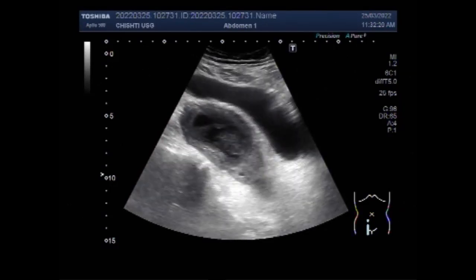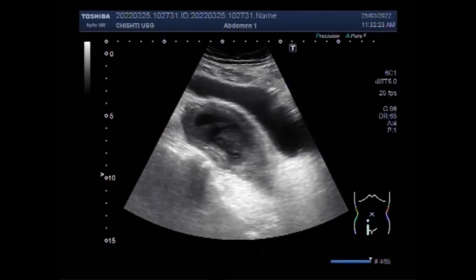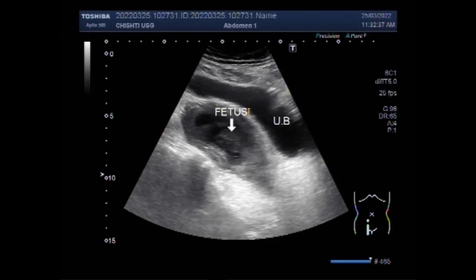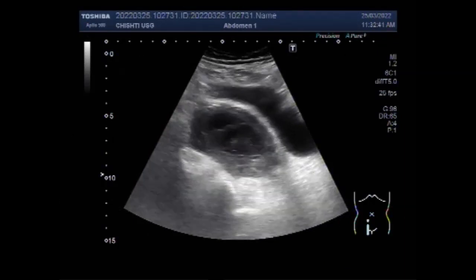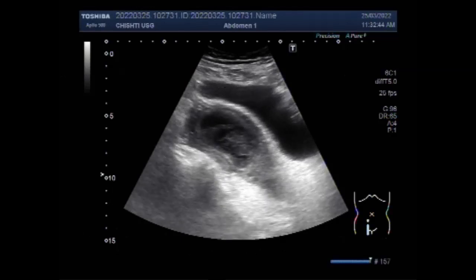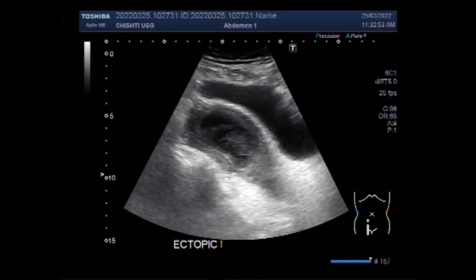Now you can see a small embryo in the right ovary. A small amount of fluid in the cul-de-sac is normal and usually is of no concern.